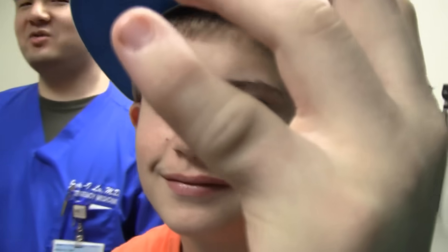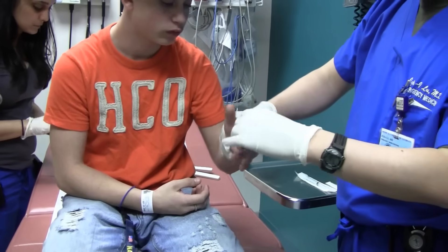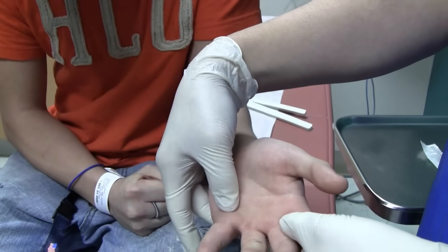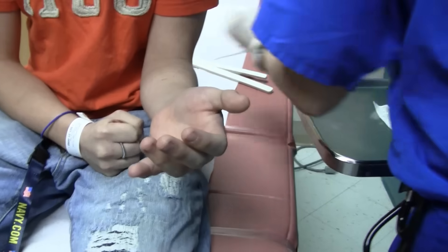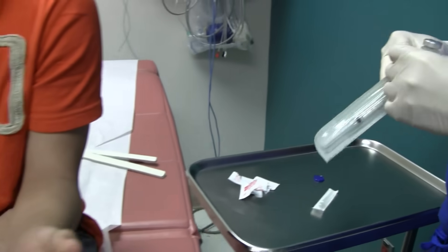Alrighty, so we have an x-ray. That finger shows a dorsal dislocation of the middle phalanx onto the proximal phalanx. My plans are to do a metacarpal block of the fifth digit followed by a reduction of the dislocation. My assistant here, Dr. Kosho, will be doing the reduction and I will do the metacarpal block. His is a little more complicated because his finger is slightly contracted, with some deformity from the contractures of the tendons over the metacarpal head. We'll be using 1% lidocaine without epinephrine and a 27-gauge needle for the injection.